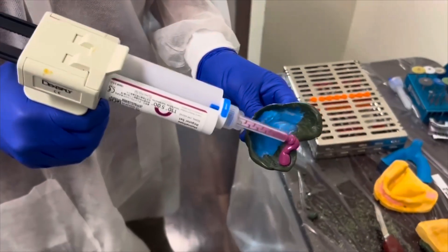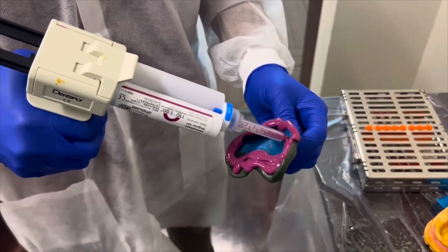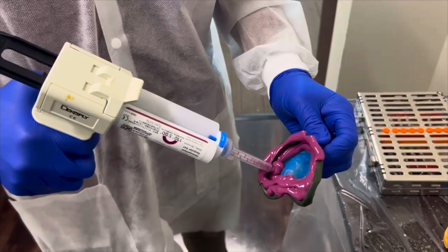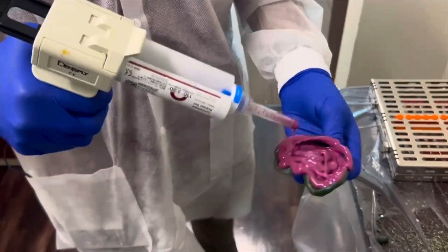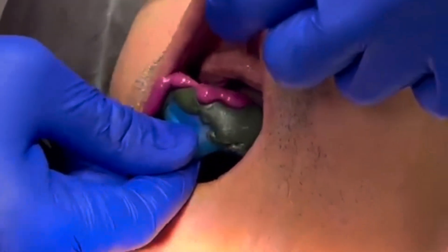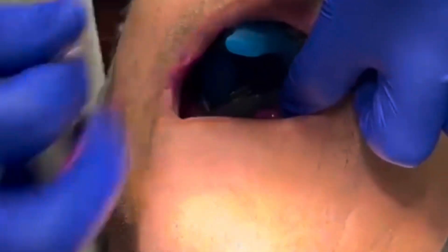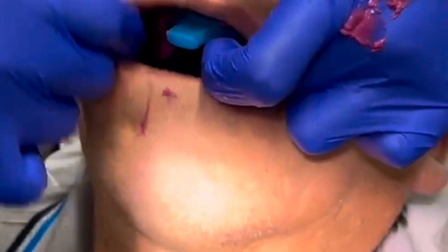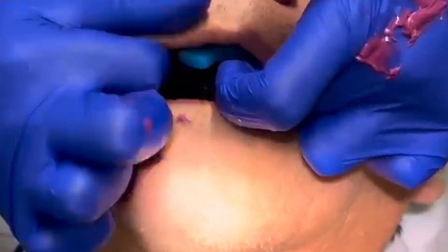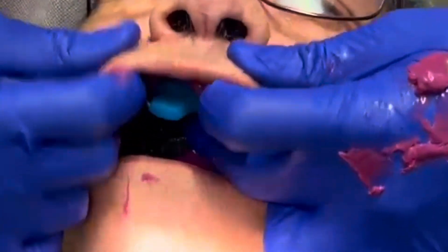I'll be using the medium viscosity impression material, applying it all along the border and then making a spiral on the inside all the way to the central part of the tray. I try to cover every little bit of the tray with an even layer, and then we're ready for the final impression. I'll seat it, making sure to move it around to ensure it's fully seated. I'll also use a mouth mirror to remove any excess that pops out of the palatal area. We perform the same border molding movements during the final impression as we did during the green stick compound molding.